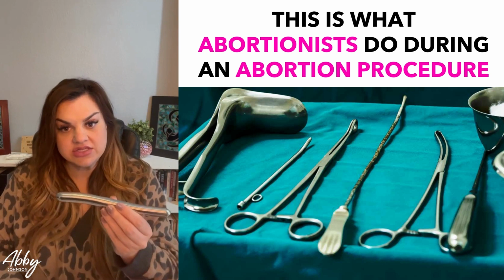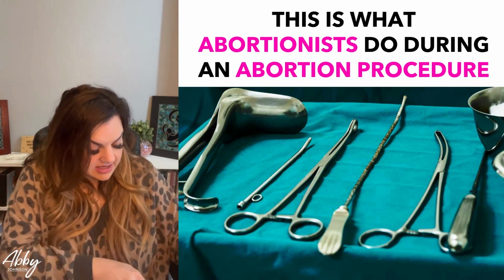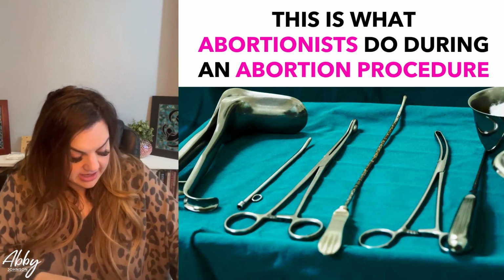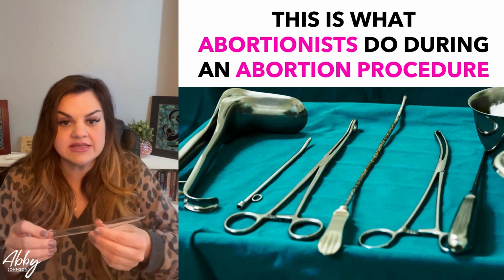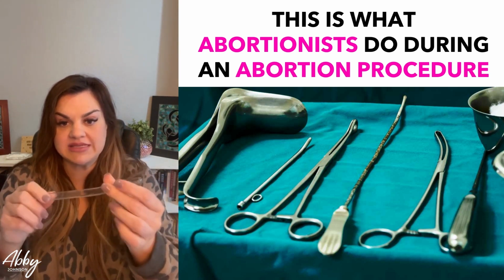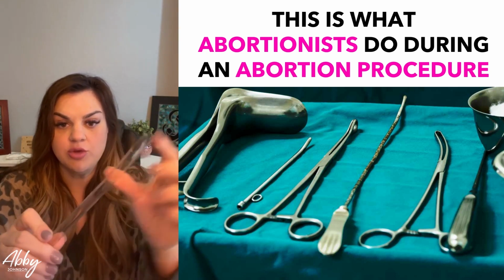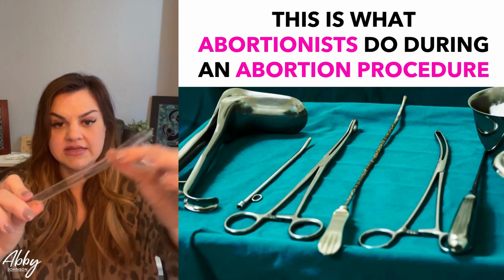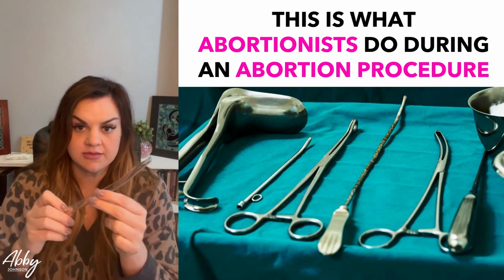And they dilate the cervix to soften it and to make it pliable enough so that they can insert something called a cannula or suction curette. And that's what this is. So this is a hard piece of plastic. It's rigid. And this is what you can see, that there's an opening here on the end. It's like a straw. This is what's hooked up to the actual suction machine.